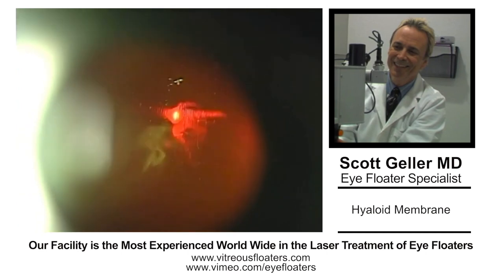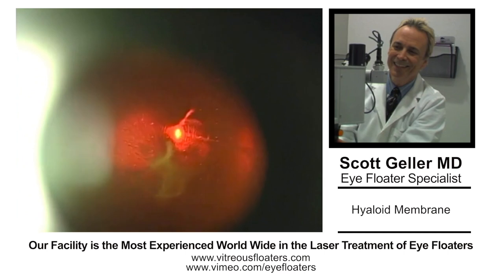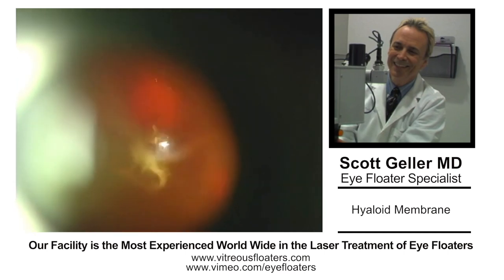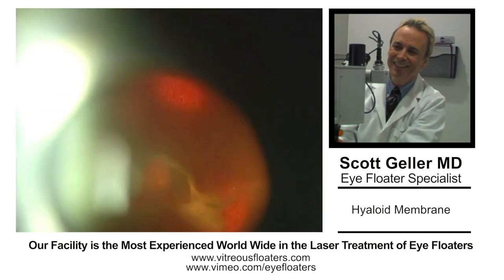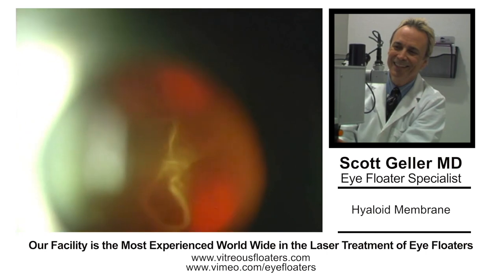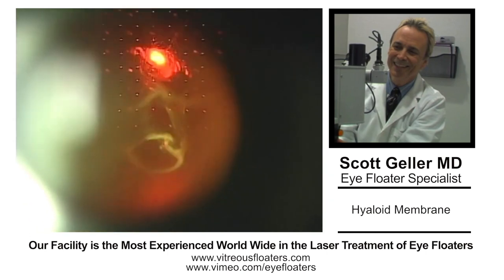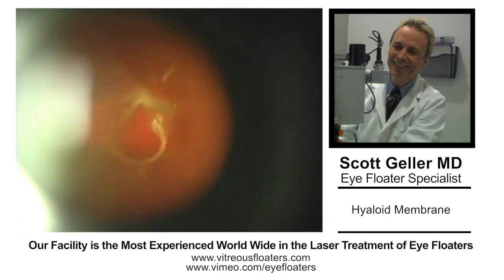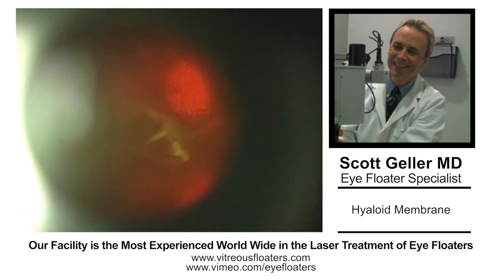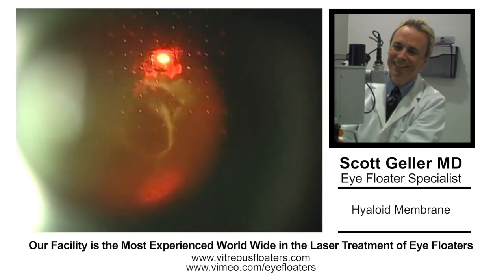The strategy here is something that you develop while you're looking at the opacity. I'm looking at the Weiss ring hyaloid opacity and the thickened hyaloid membrane from a posterior vitreous detachment. Our strategy is to cut the Weiss ring away from the hyaloid, creating a window. The window will retract both laterally and medially, allowing the patient to see clearly again.